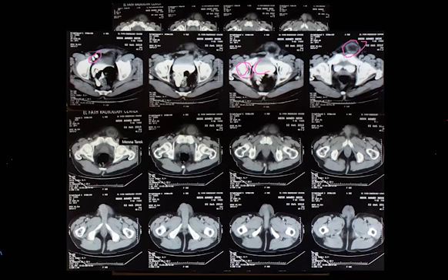شوفي ايوه اهم شايفاهم the two femoral vessels which is the one that contains contrast. انهي اللي contain contrast؟ الارتري. Is it lateral ولا medial؟ Lateral. It's lateral. But this is the femoral artery. And how about the structure that lies medial to it? الفيمورال vein. الفيمورال vein that lacks contrast.